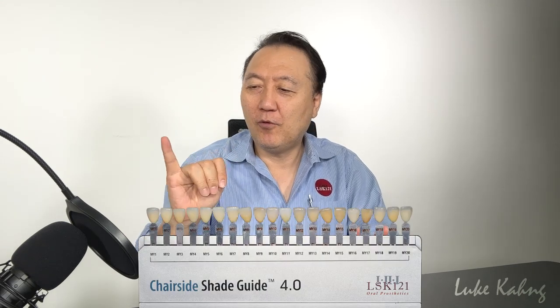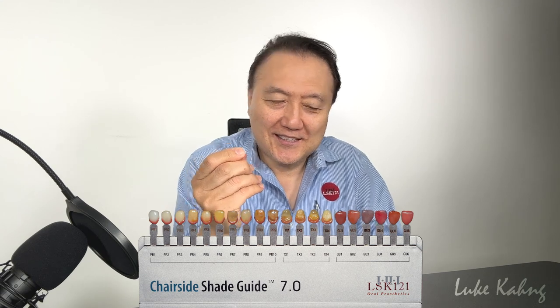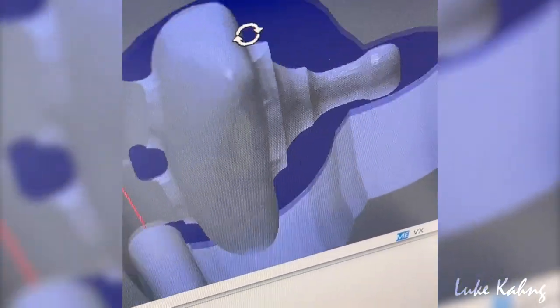So you can see my background. I made 1.0 the paper, 2.0 the paper, 3, 4, 5, 6, 7, which is ceramic. I made lithium disilicate. Now I have fabricated zirconia, but the problem is it's hard to fabricate. But nowadays there are great CAD/CAMs. I have a lot of milling machines here.